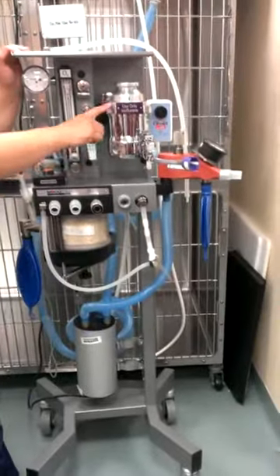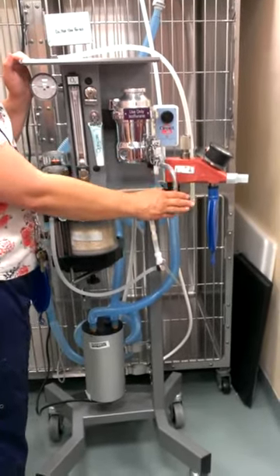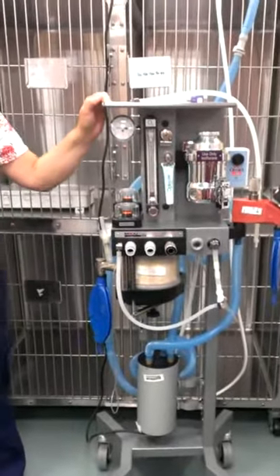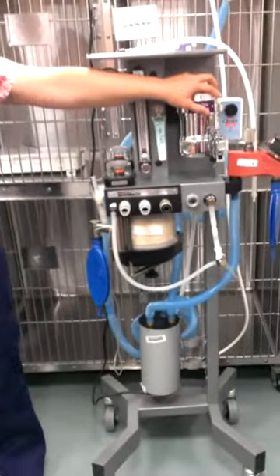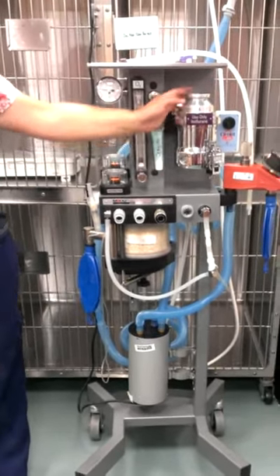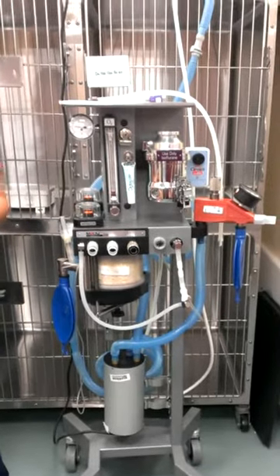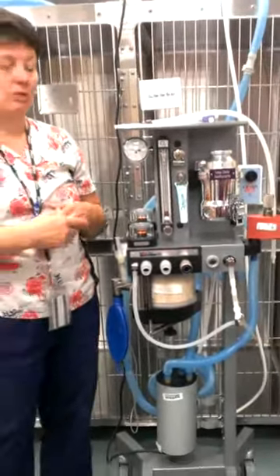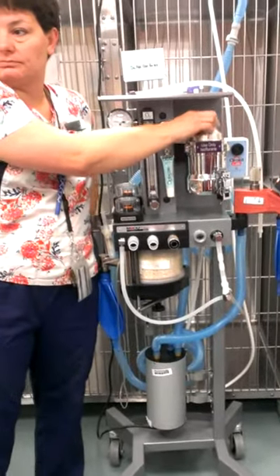If emptying the vaporizer, you can actually empty the unit — that's what the bottom hole is for. Turning the screw empties it back into the bottle. These vaporizers do need to be sent off for servicing, usually about once a year. They come off the machine, you empty them, package them up, and send them off to be calibrated. You need to know that if you turn the dial to two percent, you're actually giving two percent — you don't want to be thinking you're giving two when you're really only giving one because it's not running properly.